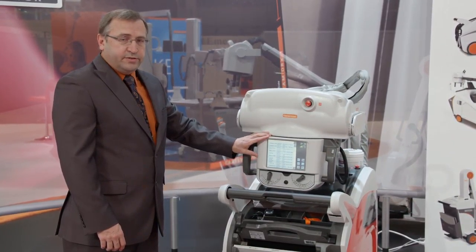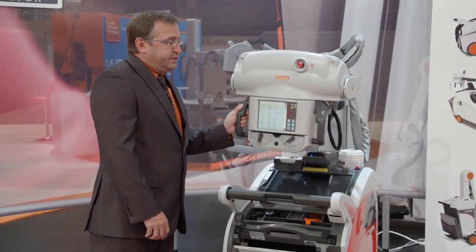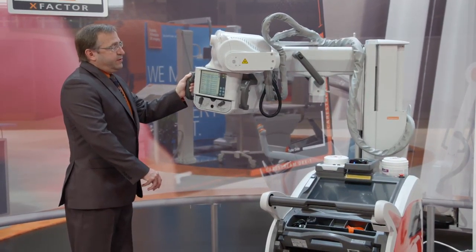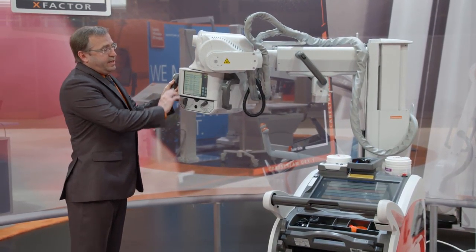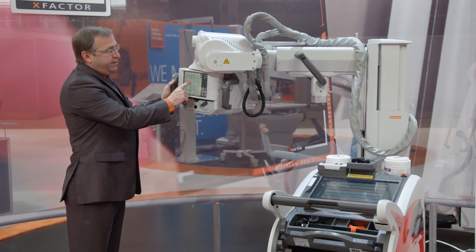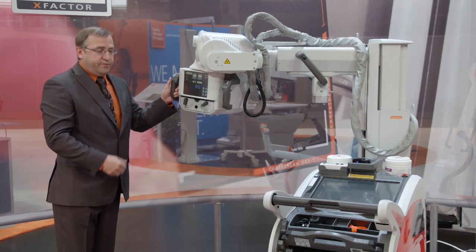It was also the first in the industry to include a touch screen at the tube head, which allows for easy positioning and improved workflow. The radiographer can work on the opposite side of the bed and have full functionality at the tube head, the same as they would have on the main work screen, without having to walk back and forth.